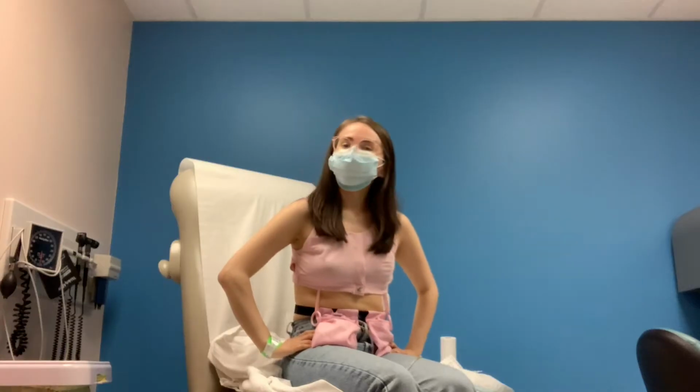It is currently Saturday and the clip that you guys saw was Friday. I got my first fill. If you're totally confused and don't know what I'm talking about, depending on the surgery and what kind of cancer you had, whether or not you had the breast cancer or BRCA gene, when you get a mastectomy, you could either go direct to implants or first to expander, then to implants.